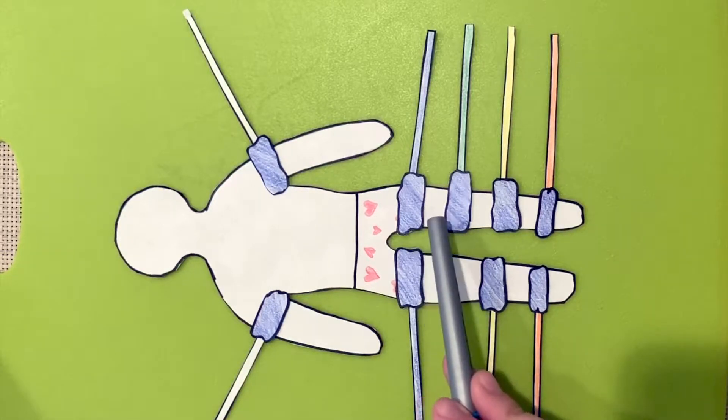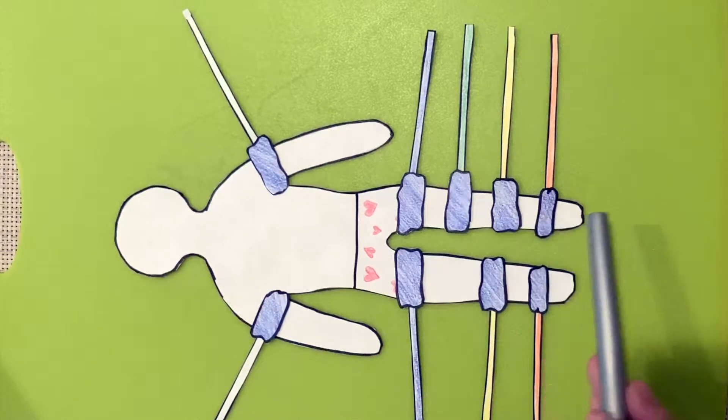The four-cuff method will include two thigh cuffs, a calf cuff, and an ankle cuff, shown here on Gary's left side.